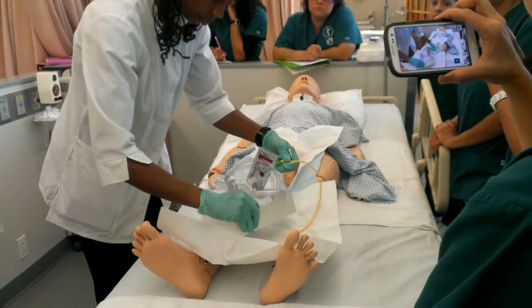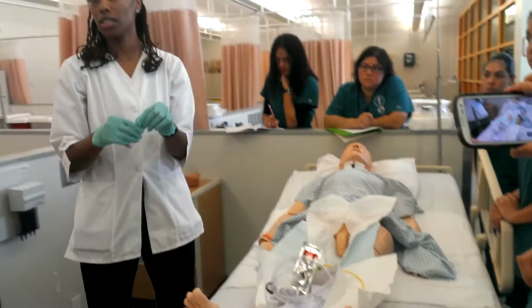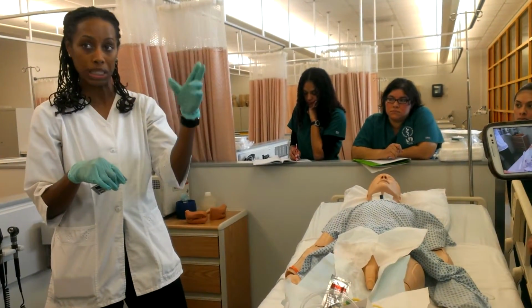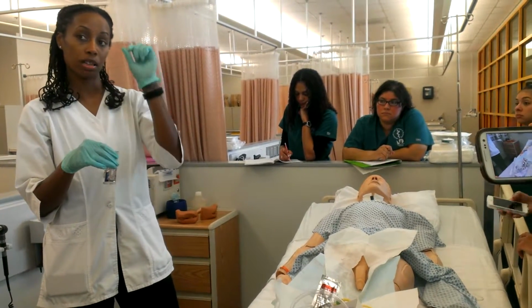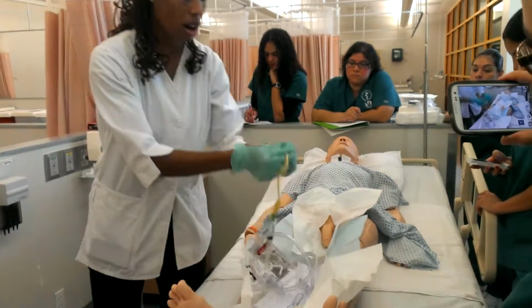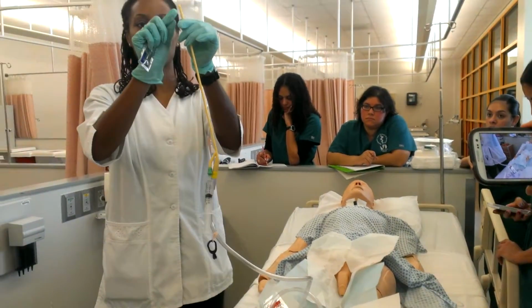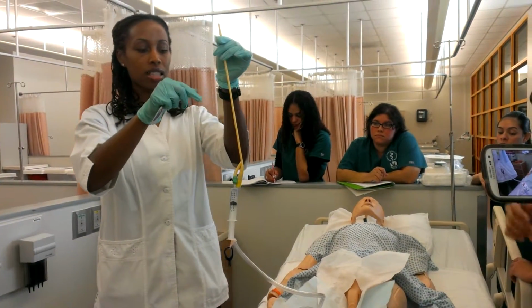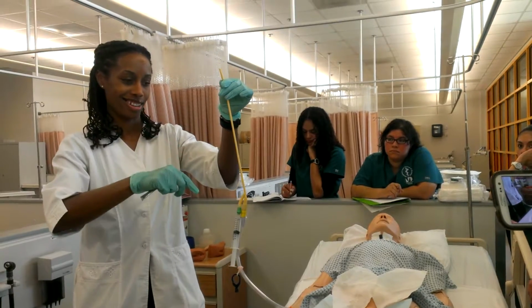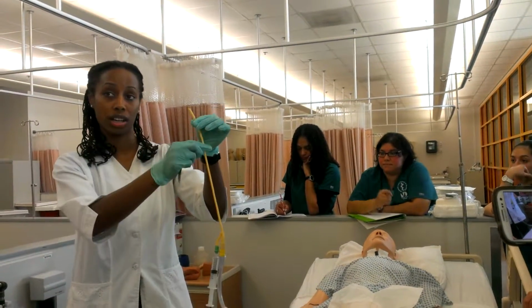So what French size for the male? It can still be 14, 16. It's where they do the prostate surgery that they'll do the 22, 24, 26. That's because they need the blood clots to come out of the body. If it's this small, then blood clots are not going to come out. So it has to be a bigger opening than that. That's why they'll use the really big 28 French. Jesus. Yeah. But they're put in surgery, so the men don't feel the insertion of it.